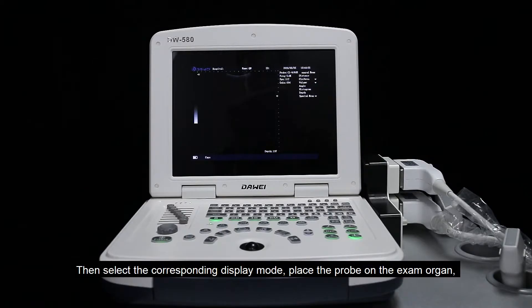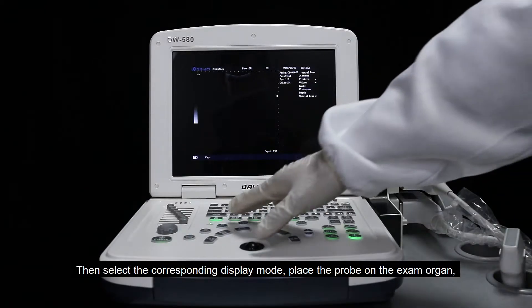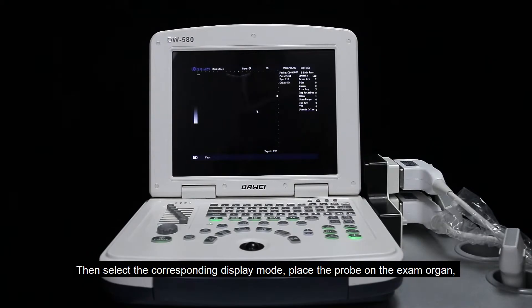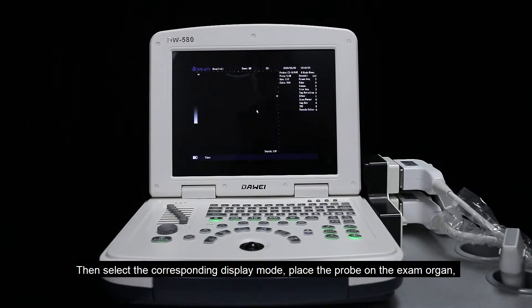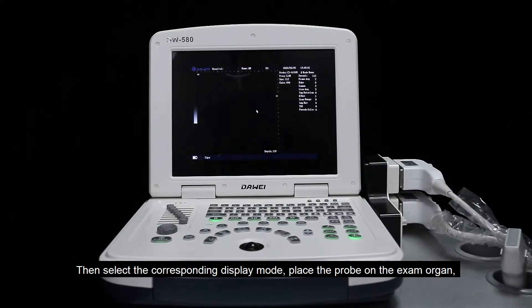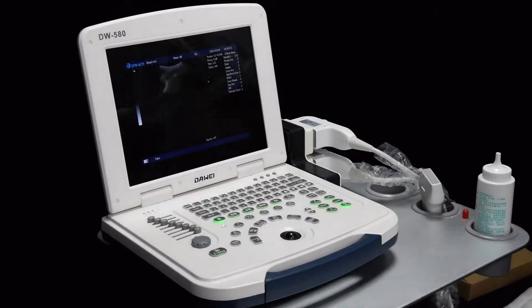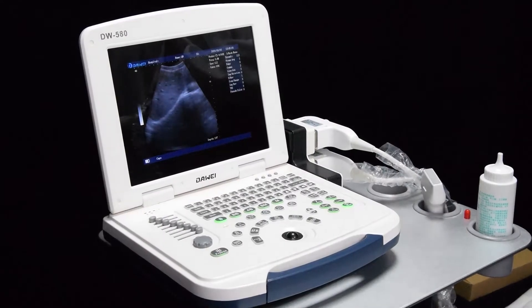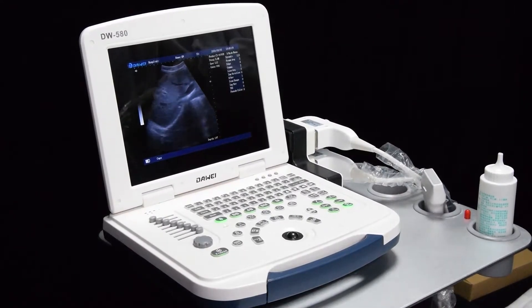Then, select the corresponding display mode. Place the probe on the exam organ and obtain the real-time scanning image.